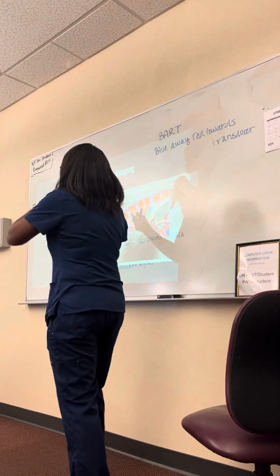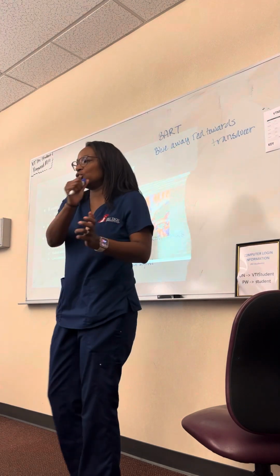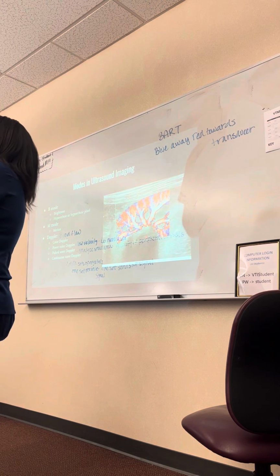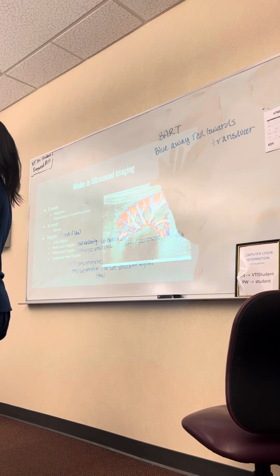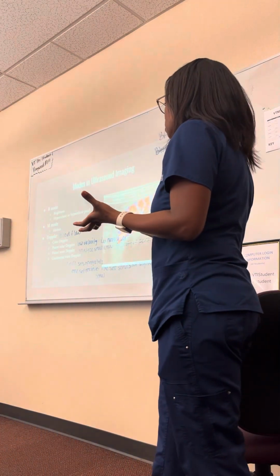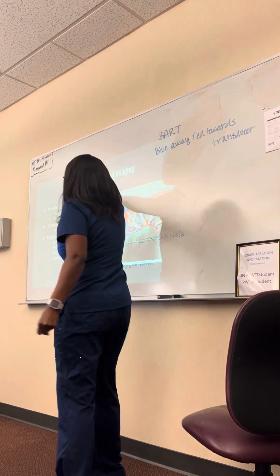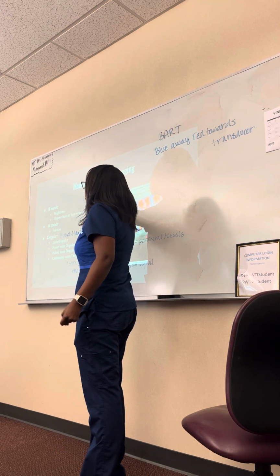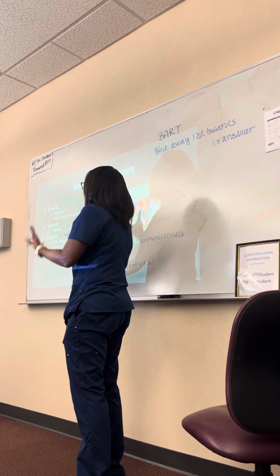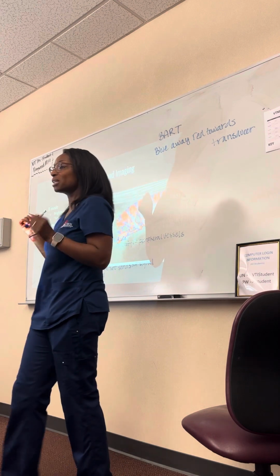So that allows me to continuously view something for a longer period of time. In our normal B mode setting, the same crystals are receiving and emitting the signal, whereas with continuous, I have different sets that are receiving and emitting the signal. So that's how that's different.